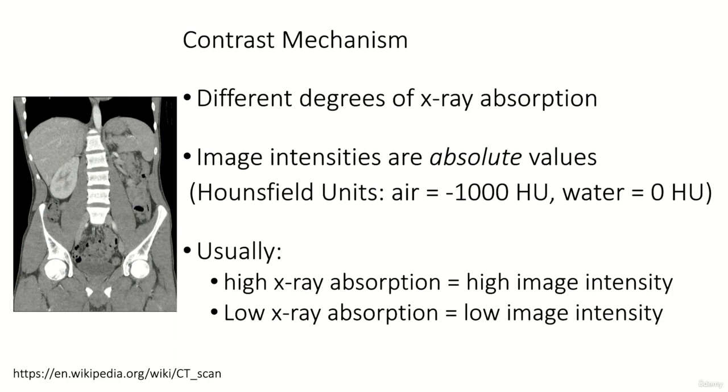Another difference to projection radiography is that distances between single voxels, a voxel is a pixel in the three-dimensional space, can be exactly quantified and directly correspond to the physical distances.